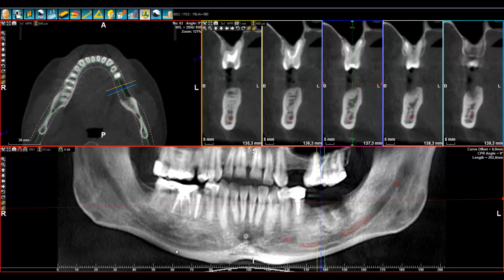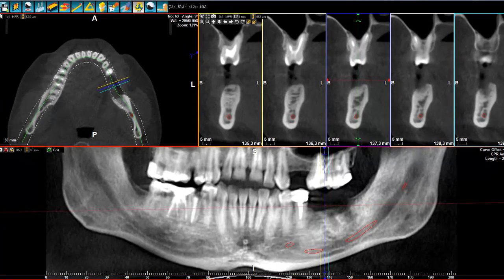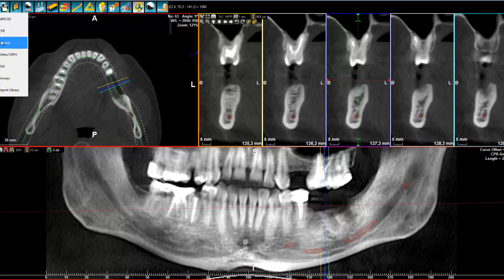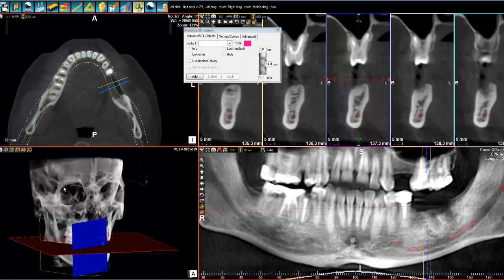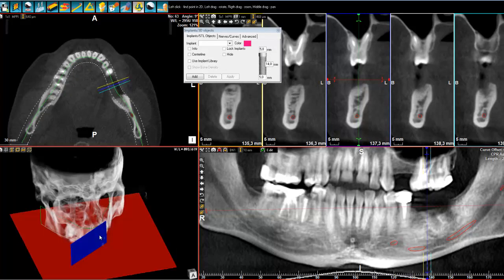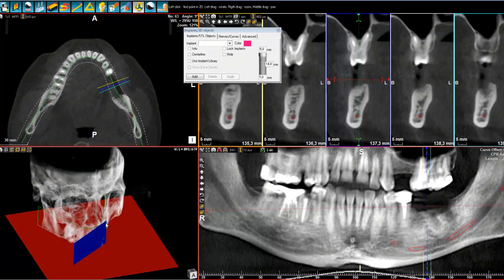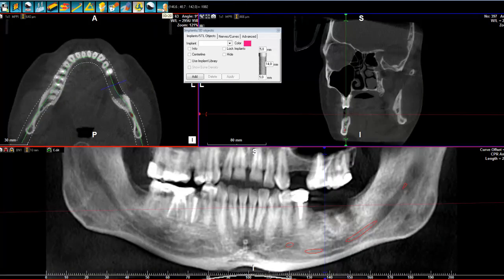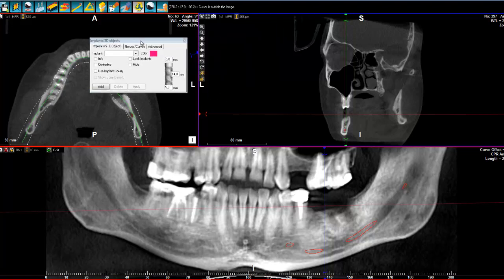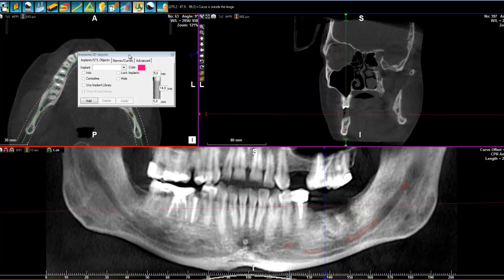Now let's see how we can place an implant — it's very, very simple. Now that we have checked our panoramic, I can simply have this option on, or click on this icon here. My view will change. I personally don't like to have the 3D view because it tends to demand a lot of capacity from my PC, so I will remove it. We are going to place an implant like that.